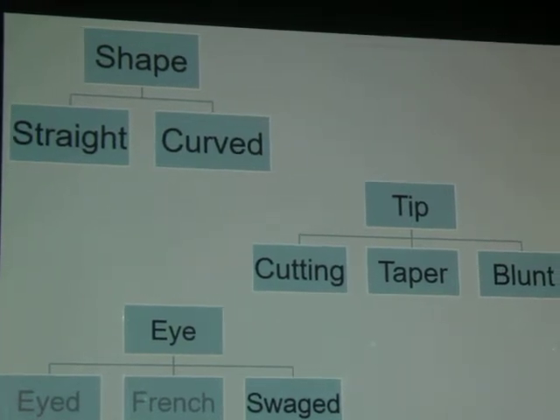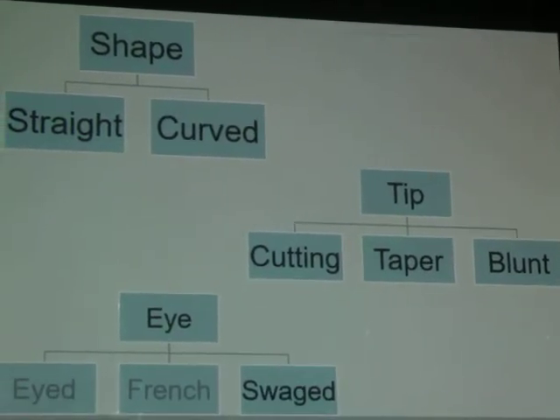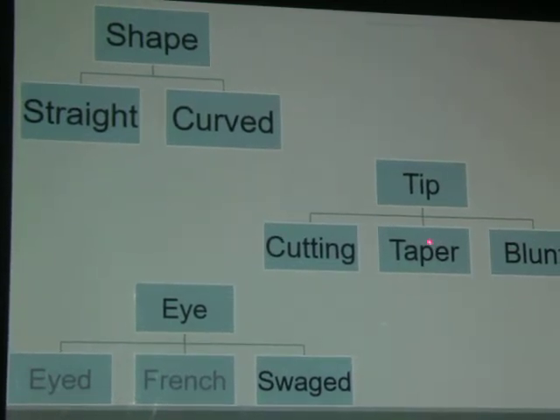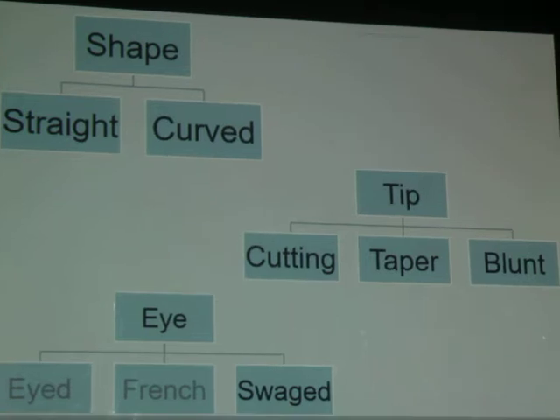Straight or curved، سهلة. Straight needle or curved needle, it is not as simple as that. The tip and the body of the needle itself, is it cutting, is it a taper tip or a blunt end, and the eye. زمان كان عندنا إبر لضم، ما أعتقدش حد منكم حضر إبر اللضم. حضرتوها يا فندم، كويس، أنت عجوزة بقى.